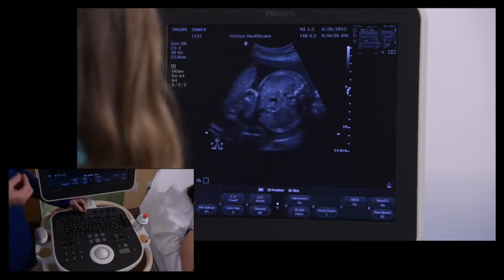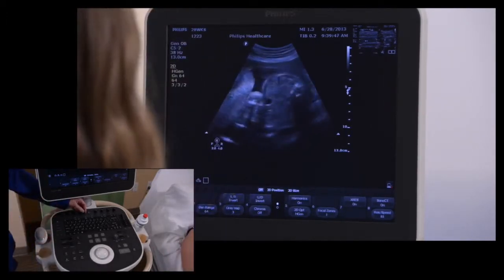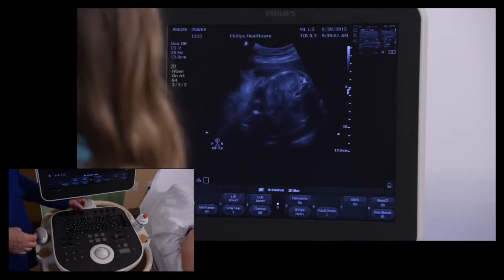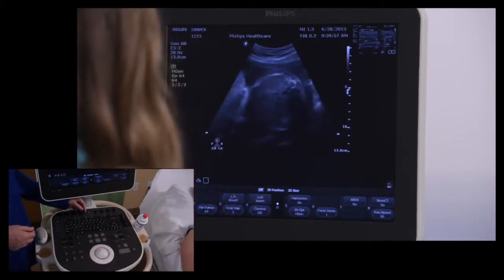In OB, not necessarily, but there are some instances where people learned somewhere else and they scan backwards. Why, for the life of me, I don't know. Yeah, we can't teach it that way. No, we can't. So we'll teach it the right way. And I understand in image guidance, needle guidance, some physicians would prefer to see the needle coming in from a certain direction, so you may have to left-right the screen. That makes sense to me, that's fine.